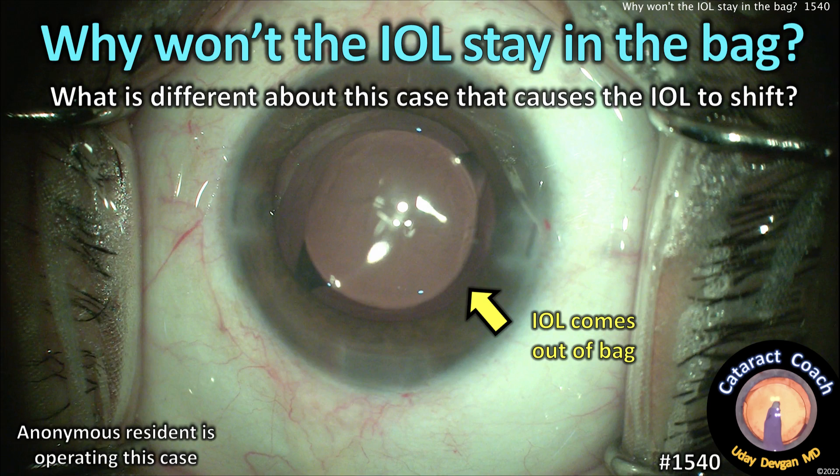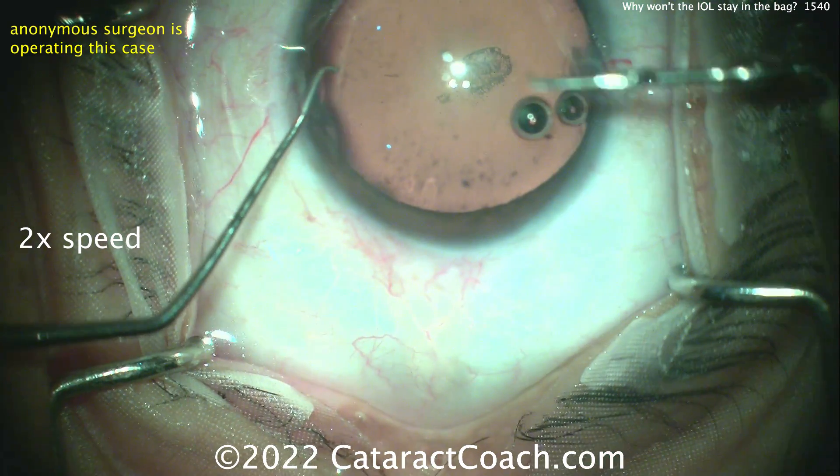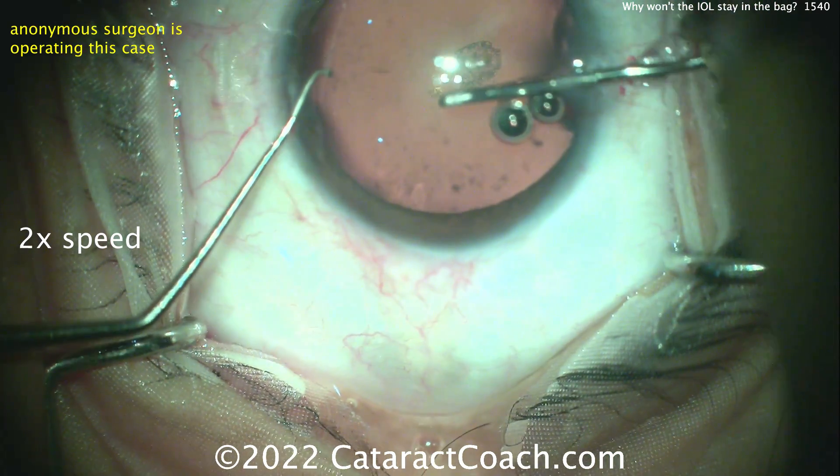CataractCoach.com. Why won't the IOL stay in the capsular bag? So what's different about this case that's causing the IOL to shift? Play along with me and let's see what happens here.